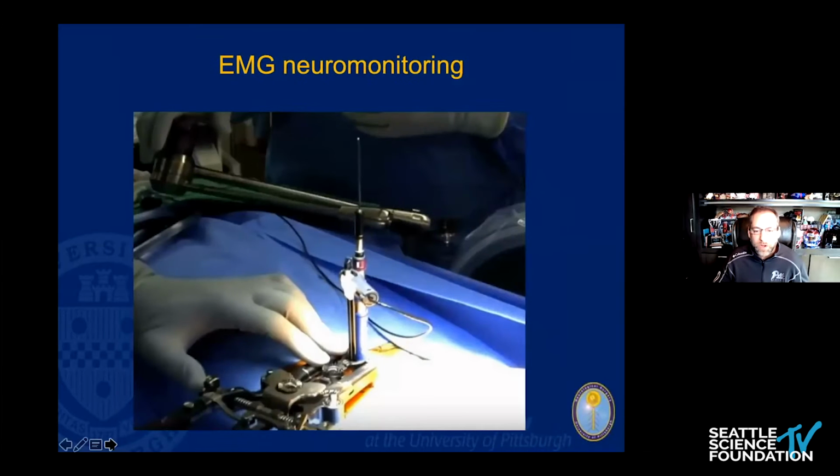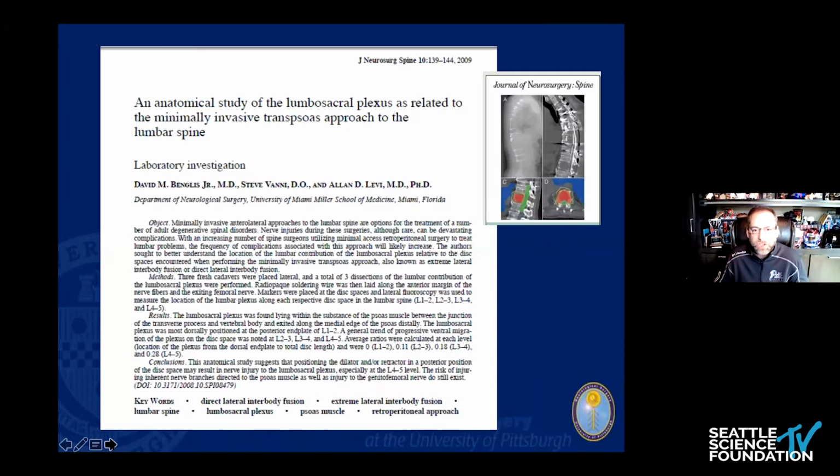So important. We'll keep talking about these, but this is one of the reasons monitoring has become so important as this procedure has evolved. Remember, lateral access surgery has been around for a heck of a lot longer than 20 years. It was just often abandoned because of the types of injuries and complications that were occurring. And I feel like when this all came about 20 years ago, and became much safer in contemporary practice, it's because of the addition of the monitoring.